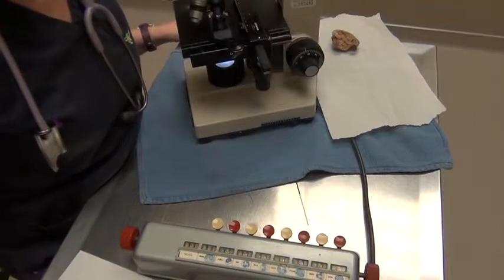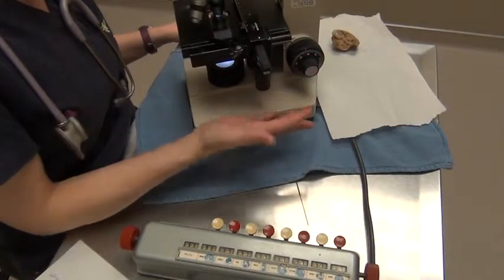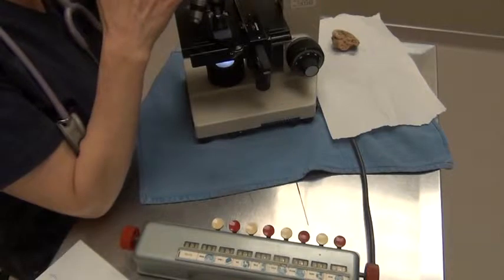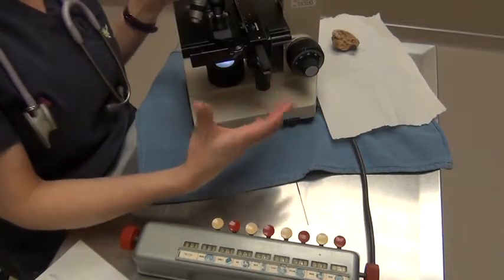Here we're going to go ahead and do our platelet estimation now. I'm going to count the number of platelets I see per field, and field would be obviously the view that you see in the microscope. It's just one field, and each time you move the slide, that's another field.